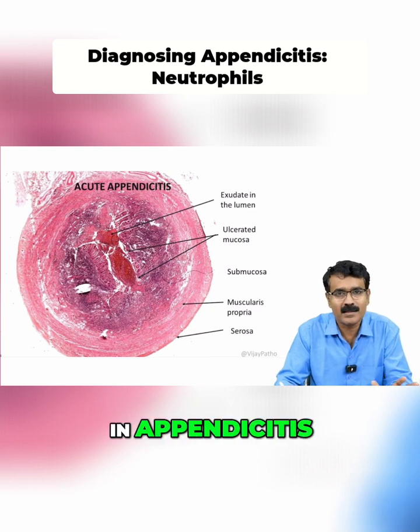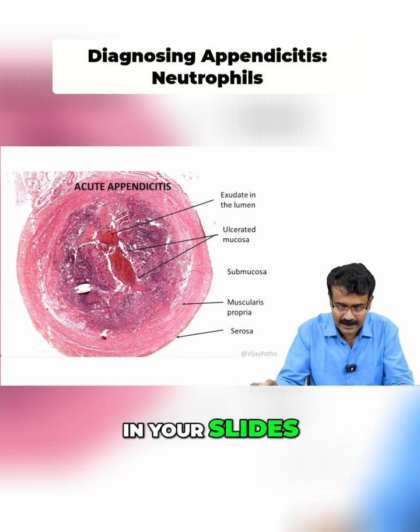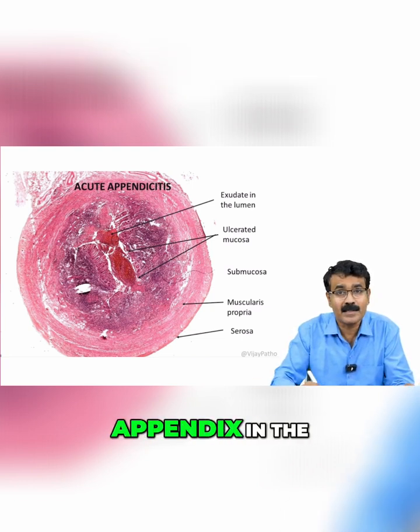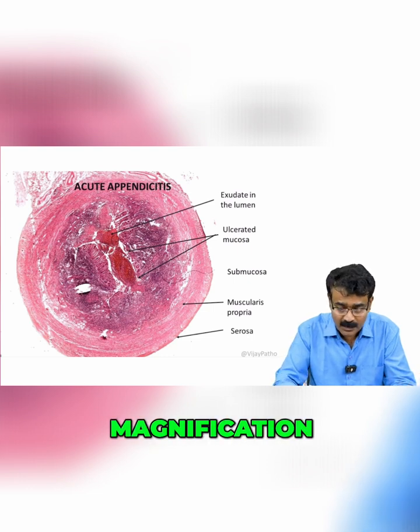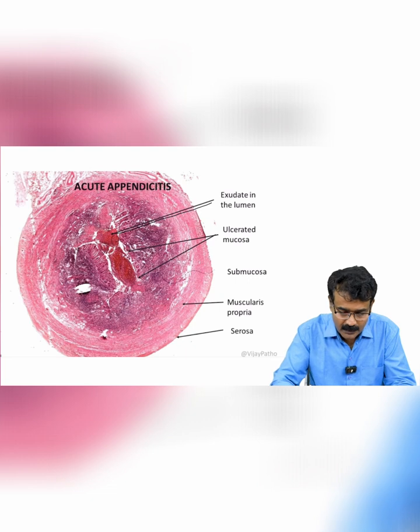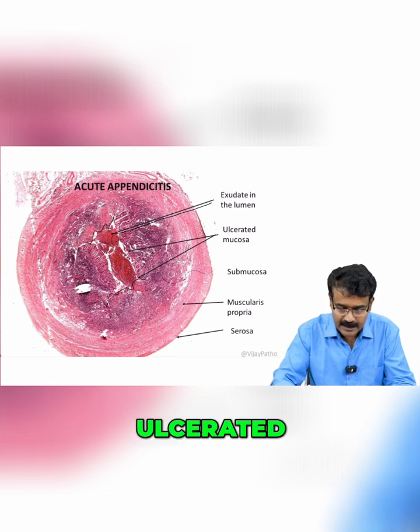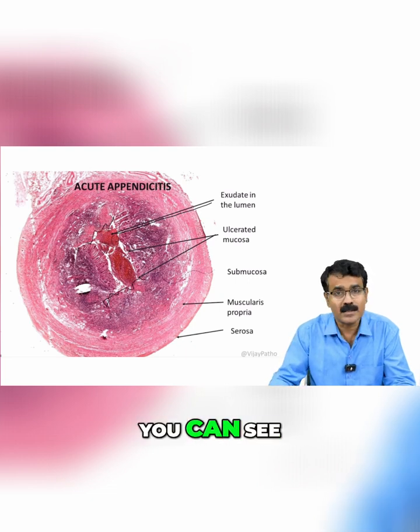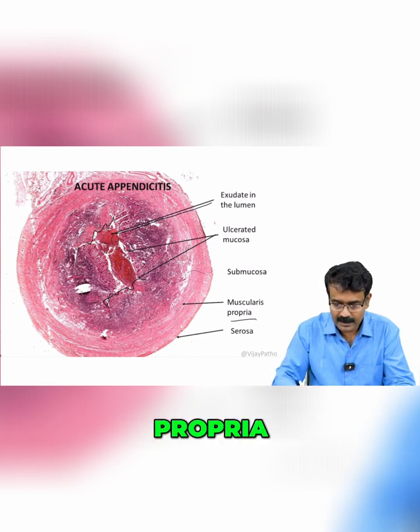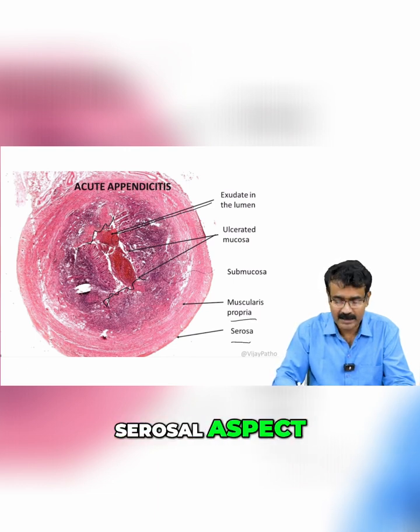What do you see in appendicitis in your slides? You can make out the entire section of appendix in the scanner magnification. You can see the exudate in the lumen. The mucosa is ulcerated — that is the ulcerated mucosa you can see. You can even see the submucosa in this magnification; that is the muscularis propria, and that is the serosal aspect.